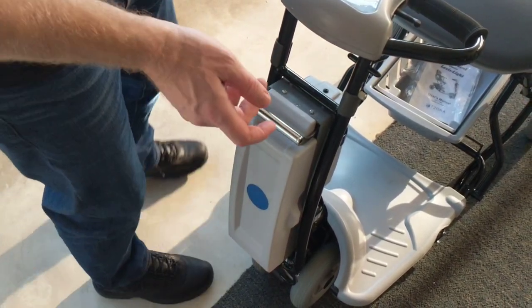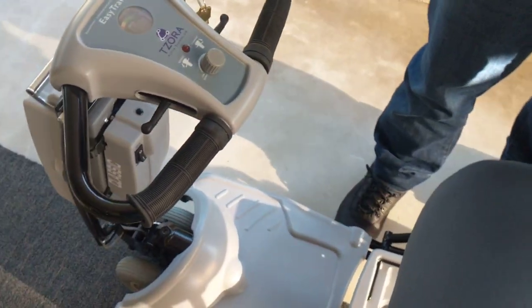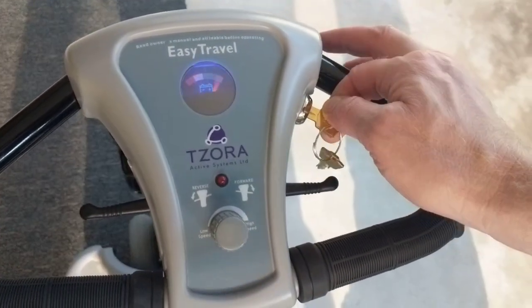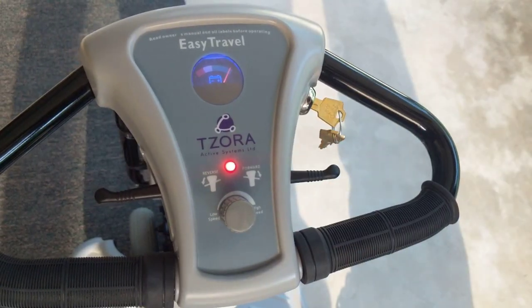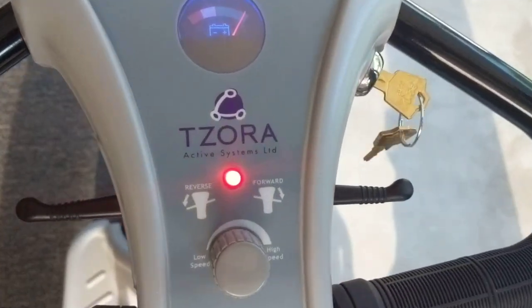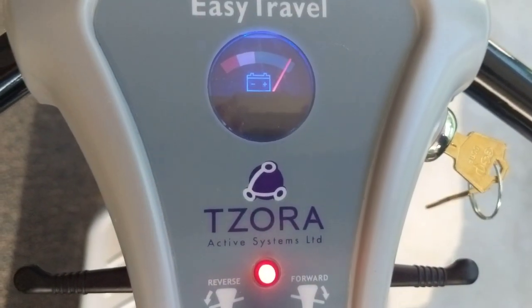Putting the battery in is very simple. Taking a look at the tiller itself, it's just as easy as the battery. You have a key that allows you to turn the device on, and as soon as it's on, you have the red light indicating power and you have the fuel cell indicator for the battery as well.